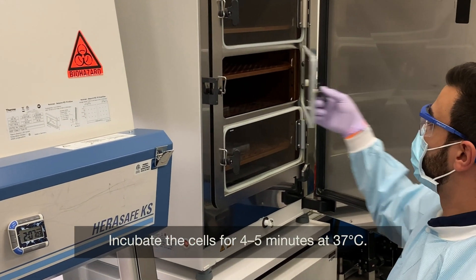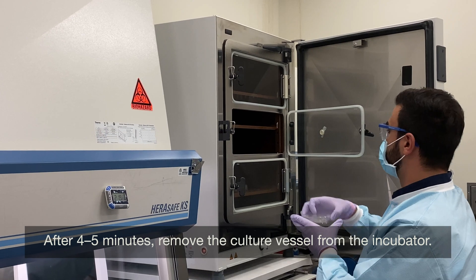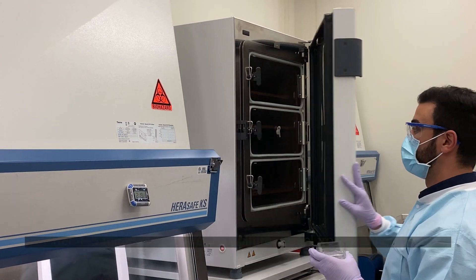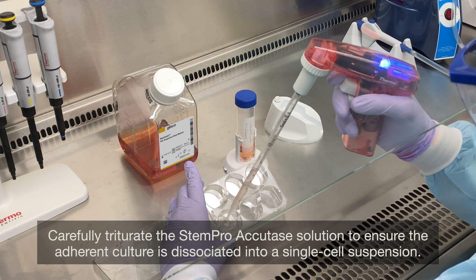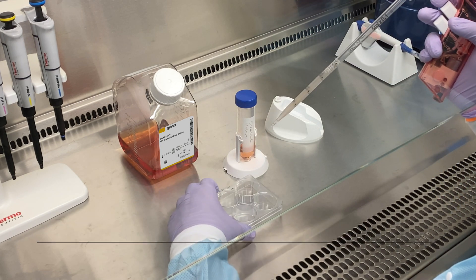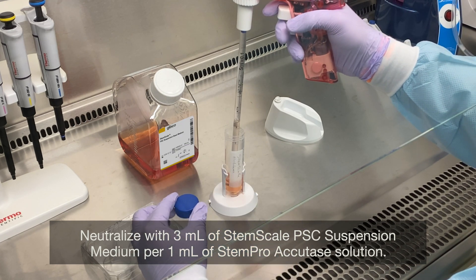Incubate the cells for 4–5 minutes at 37°C. After 4–5 minutes, remove the culture vessel from the incubator. Carefully triturate the StemPro Accutase solution to ensure the adherent culture is dissociated into a single cell suspension. Neutralize with 3 mL of StemScale PSC Suspension Medium per 1 mL of StemPro Accutase solution.